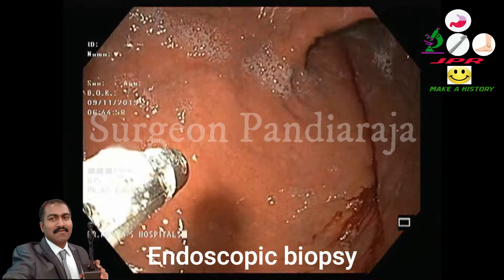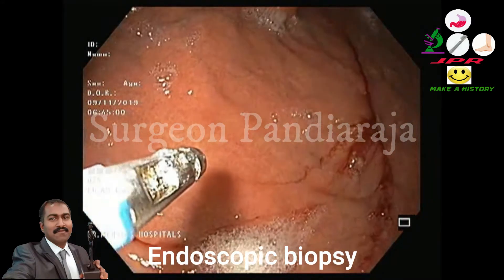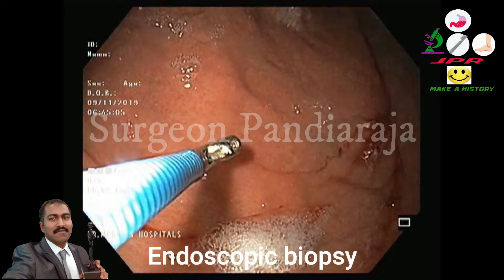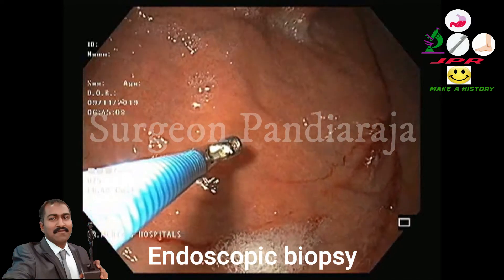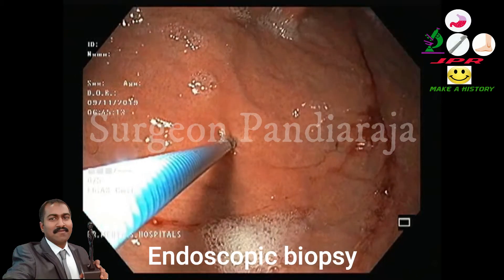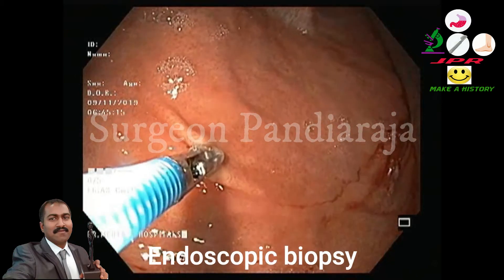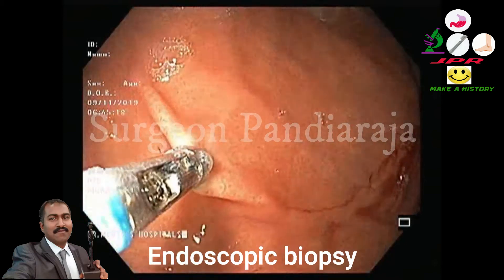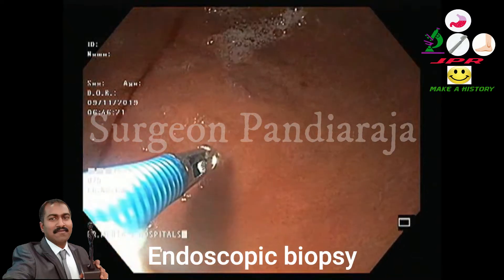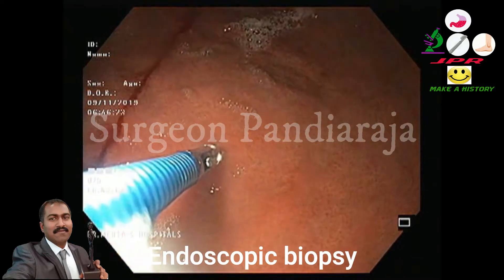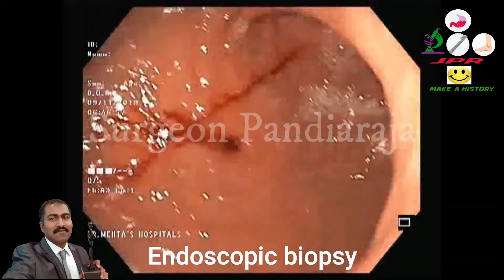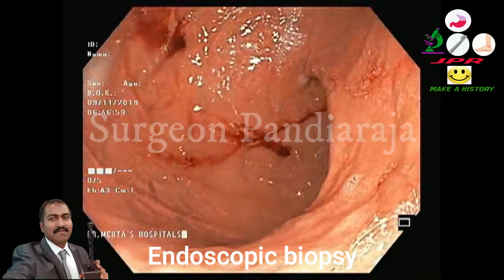Biopsy is taken from the suspected area with the help of biopsy forceps. Biopsy is also taken from inside the duodenum. The scope is then withdrawn with gentle suction.